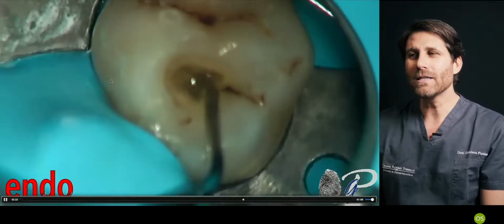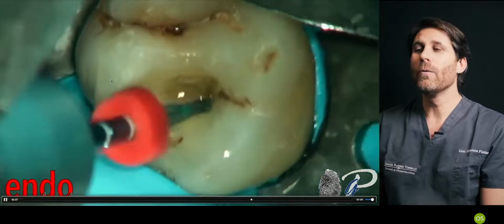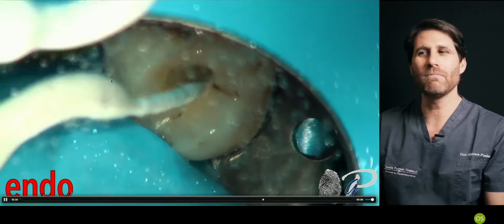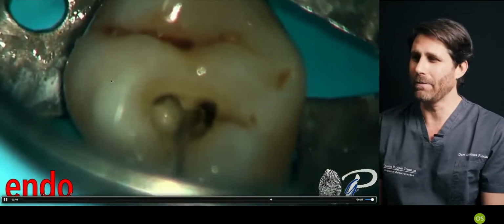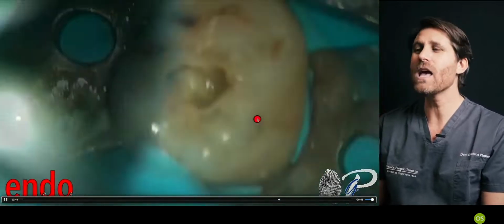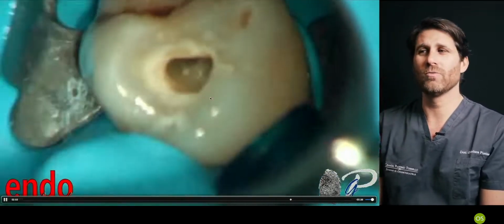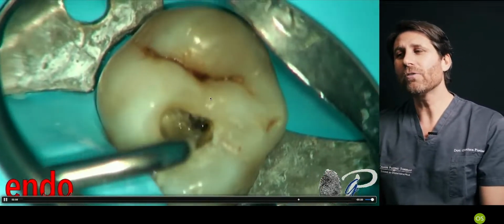If it has some resistance to advance, given some interference, we can remove that part of dentin even after we started the instrumentation. No need to open everything before without knowing the difficulties for an instrument to proceed apically. Look, there are some undercuts that we have to clean, obviously, and we will see how to do it. And we can regularize these undercuts, we can remove them in a dynamic process during instrumentation, because we feel on the instrument some difficulties to advance.